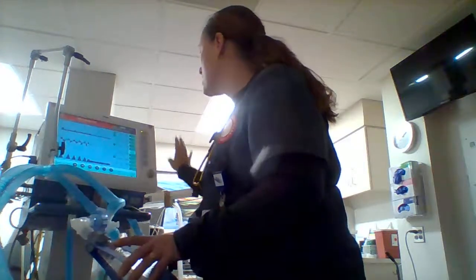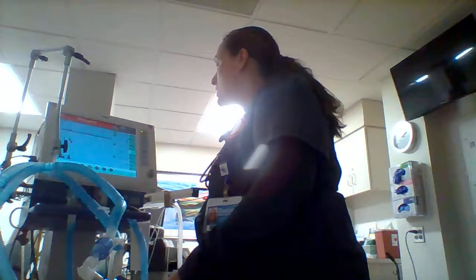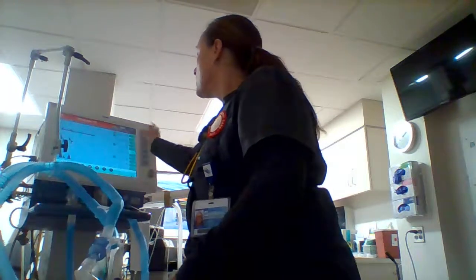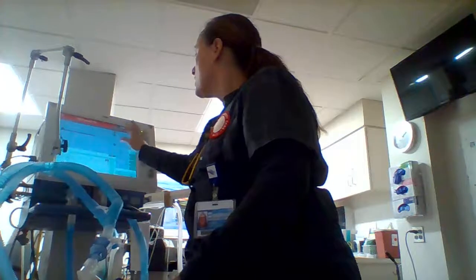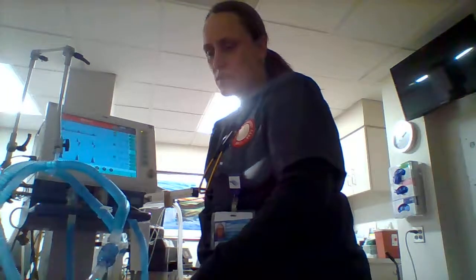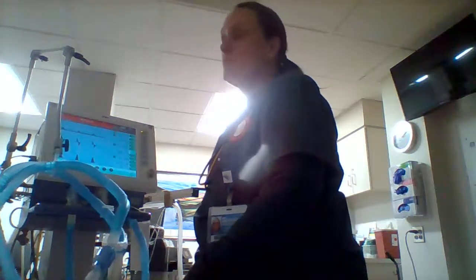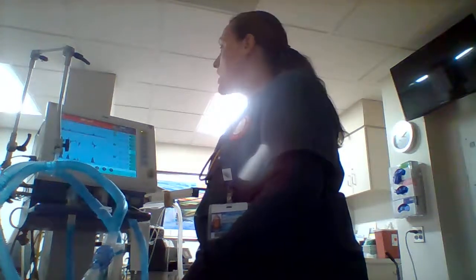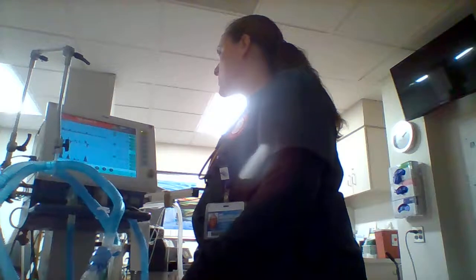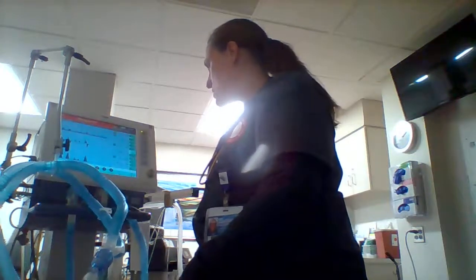Perfect. Actually the settings look good. We have a tidal volume of about 298 to 311 milliliters, which is what I was shooting for. So: ABG, chest x-ray, all that good stuff. We'll monitor and give time for bronchodilators, possibly steroids, possibly even epinephrine to help reverse her acute asthma exacerbation. As she does better we can decrease our mandatory ventilation rate and decrease the FiO2 as needed. Pressure support right now is five — that'll work.